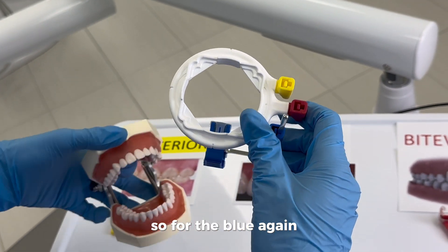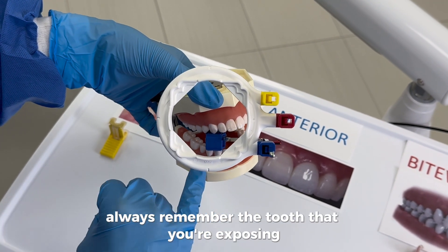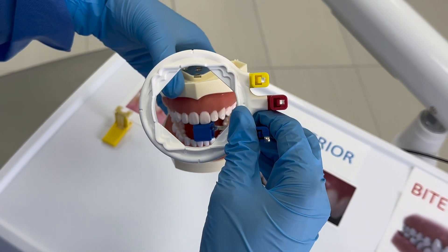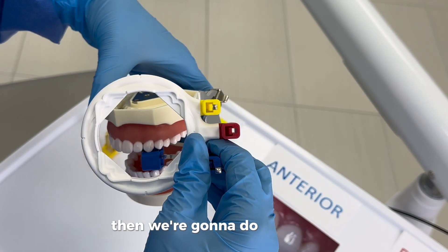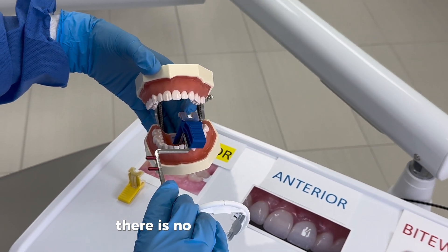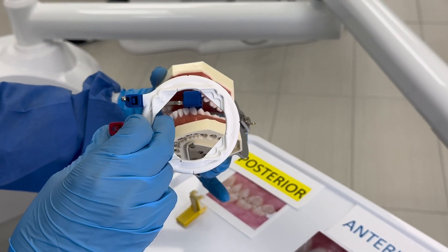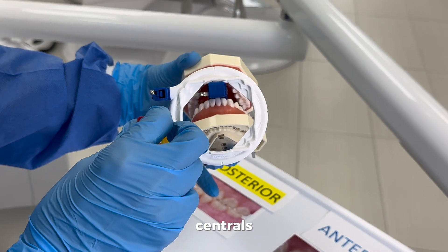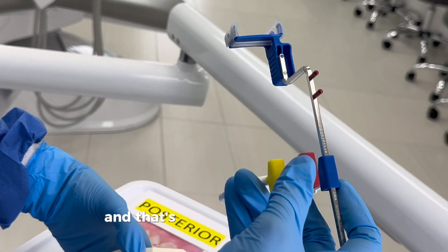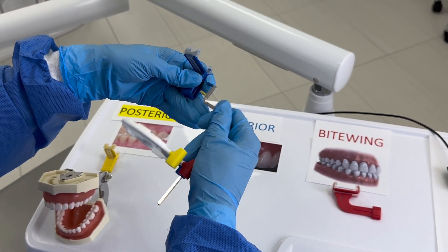For the blue we're going to do the anteriors — starting with the canine. Always remember the tooth you're exposing has to be right in the center of the bite block. Then we do the centrals, then the other canine. We take it out, flip it — there is no change on the blue — and we do lower left canine, centrals, and lower right canine. That's how you do the blue for anteriors.